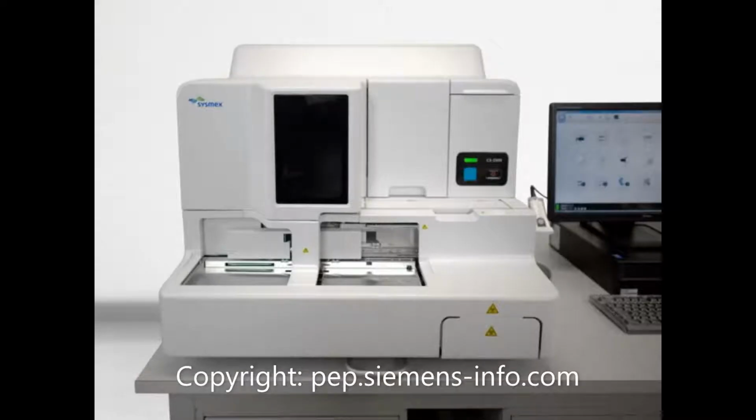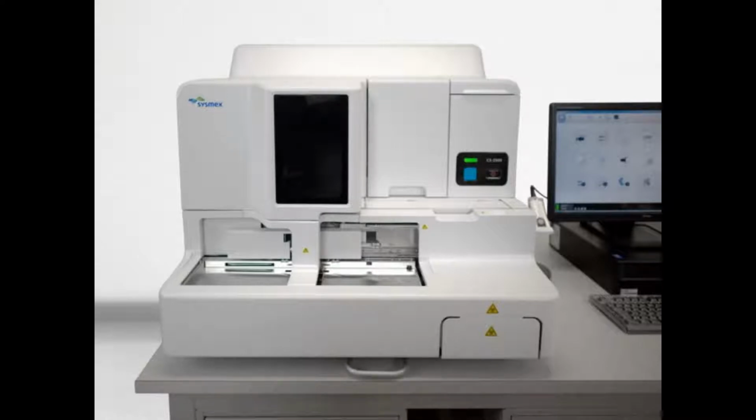In this presentation, the MLS will learn how to order, correctly load, and run 2 levels of QC while using the correct rack. This is the front view of the CS2500. The computer for ordering QC and other functions is on the right, while the analyzer is on the left. Note that the loading bay is on the right-hand side of the unit.